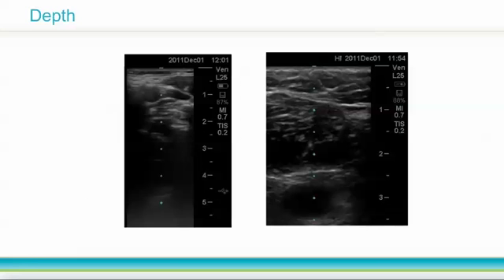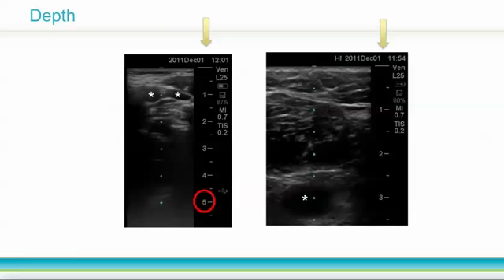Within the constraints of the transducer you choose, the depth of field can be adjusted to best visualize the structures of interest. Along the right side of each image are depth markers. The image on the left is of a patient's neck prior to central line placement: the internal jugular vein and the carotid artery are about 1 cm deep to the skin, while the overall image depth is over 5 cm. In the knobology module, we'll show you how to reduce the depth, as the structures of interest currently appear small at the top of the screen. The image on the right shows a different patient's internal jugular vein, 3 cm deep to the skin. The depth of that image must be increased to include both the IJ and carotid artery before attempting central line placement.